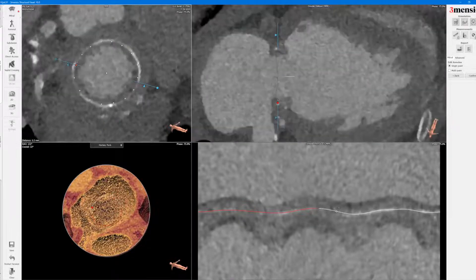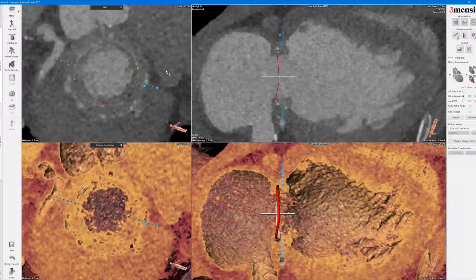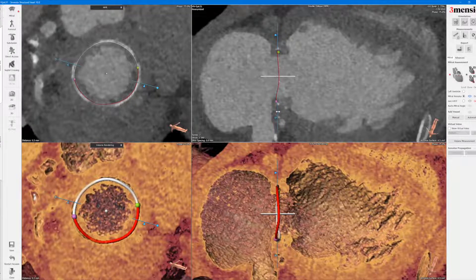So that looks pretty good. Once you have that, you click confirm. And then you go in to manually bring this line to zero.